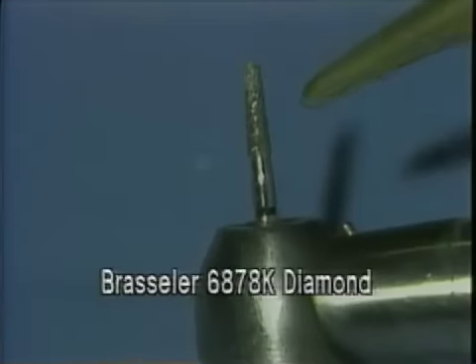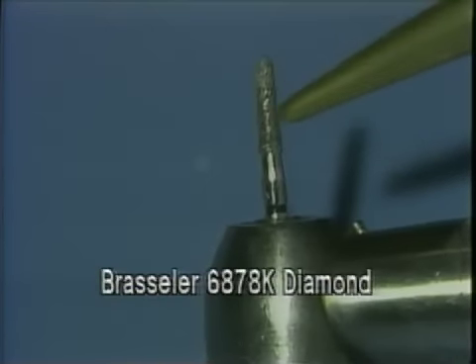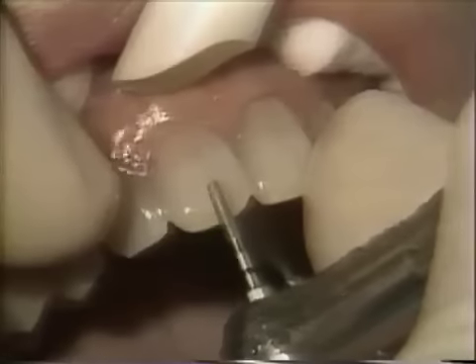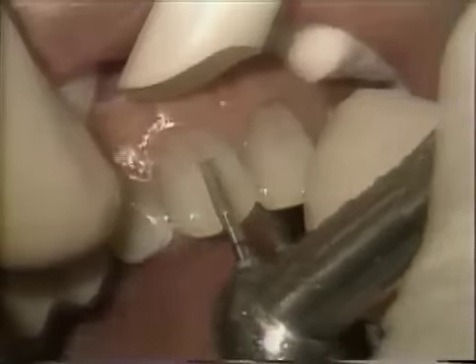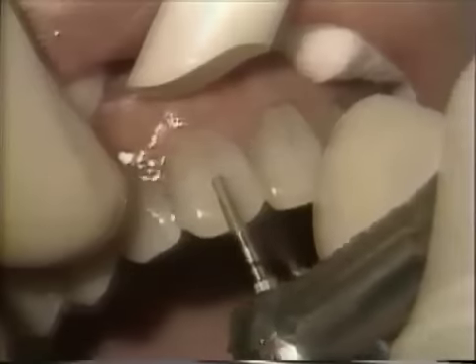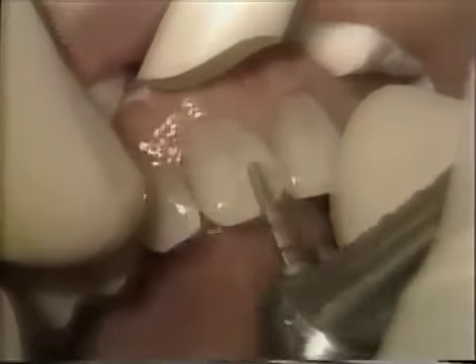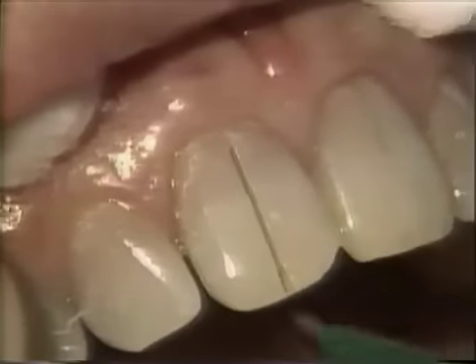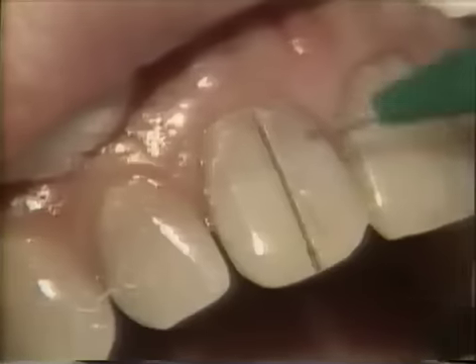The initial cut will be made with a tapered diamond with the rounded end. This will be followed with a carbide that has the same shape. What we have done now is we have made our initial tracer cut. You can see the extent of that tracer cut — it's a half a millimeter deep, not very deep.